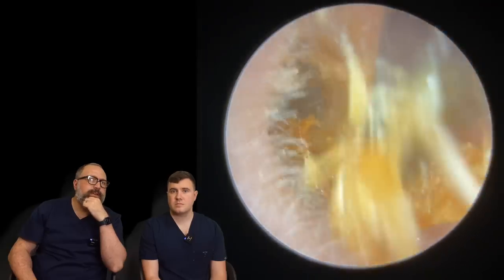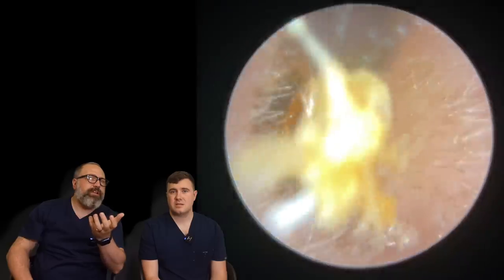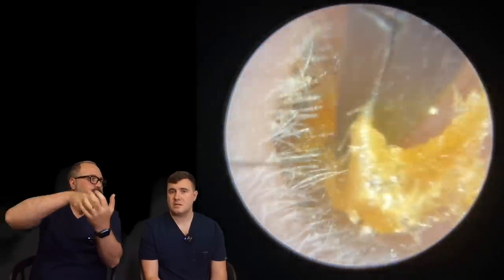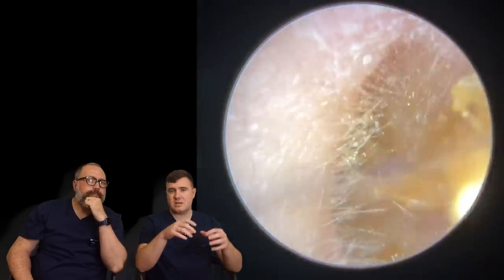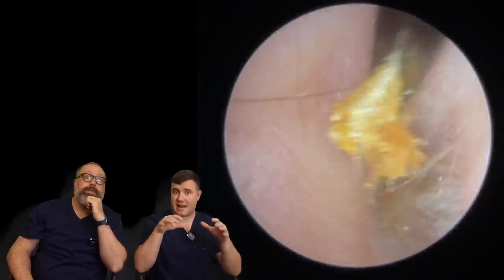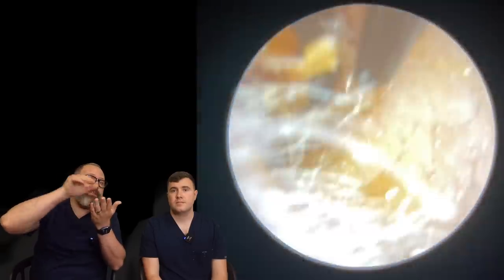Giving this a little bit of a wiggle here with the crocodile forceps. You can see the skin just disappears further in. Long strips — when you suction it, it doesn't look like a lot at the entrance, but it sort of almost unfolds and unwraps itself. Especially when it's quite dry like this, it's still usually always connected at some point deeper in the ear canal, which is why you can see us moving and wiggling around with the suction tube. The suction tube doesn't always have the force or grip to hold on — almost cigarette-paper-thin pieces.